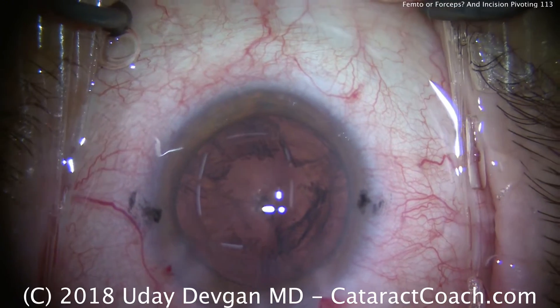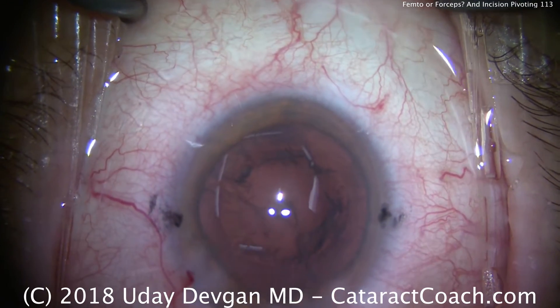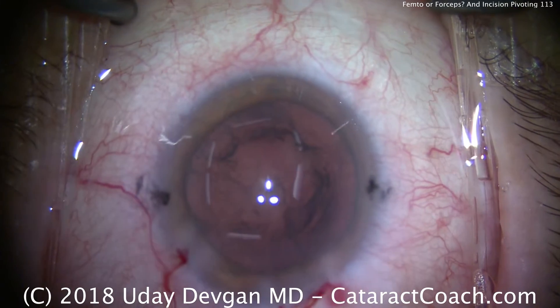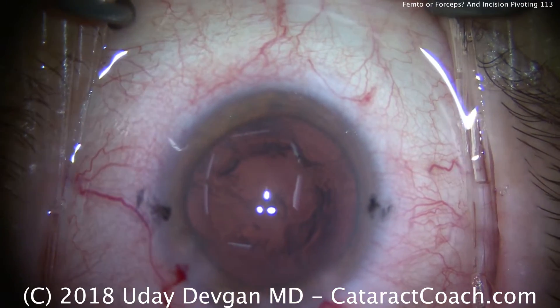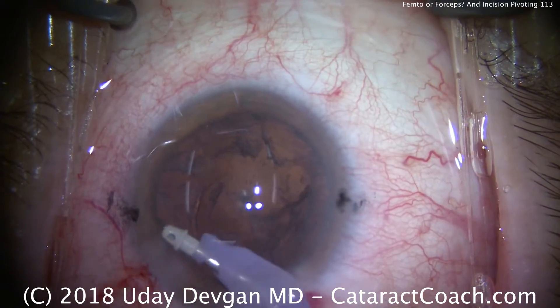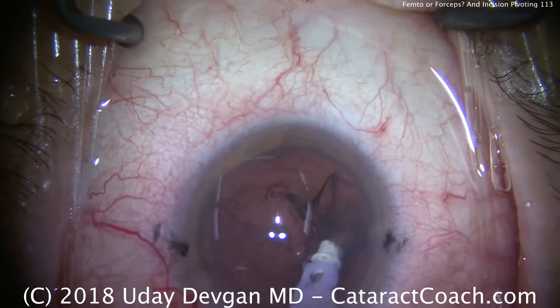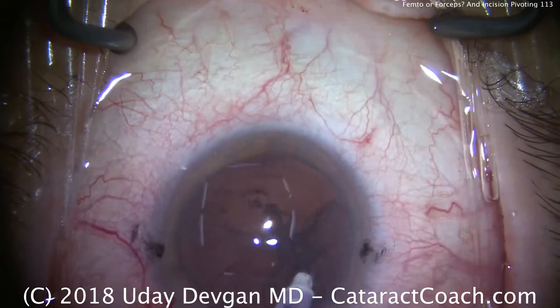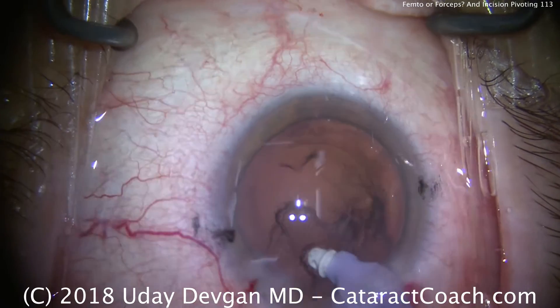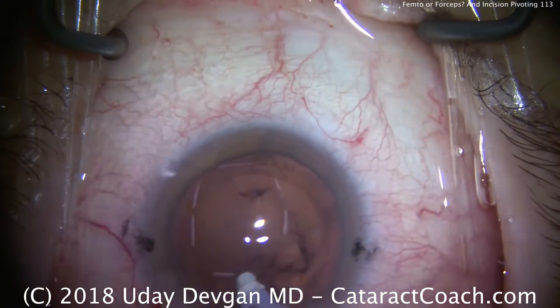I also want to talk about whether you should use a femtosecond laser or forceps to do your capsulorrhexis. Early in your learning curve — at least for the first few hundred cases — just use a manual method. Capsulorrhexis forceps would be ideal, or you can use a cystotome, but avoid using a femtosecond laser because that would be a crutch. Now we take out the rest of the cortex and clean up the capsular bag — that looks really good. You can make a beautiful capsulorrhexis with just your hands.